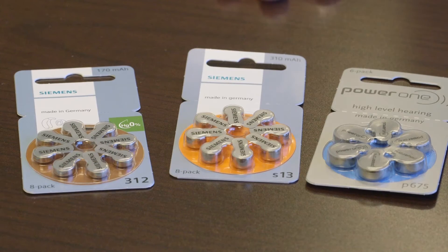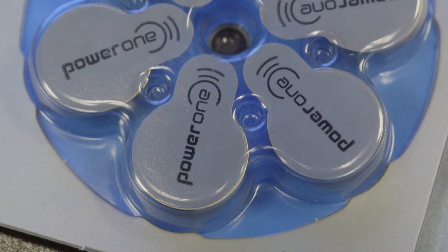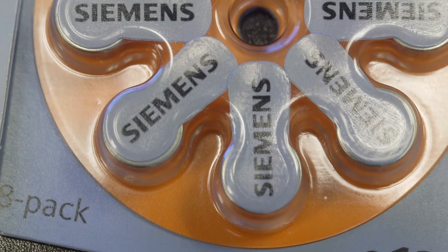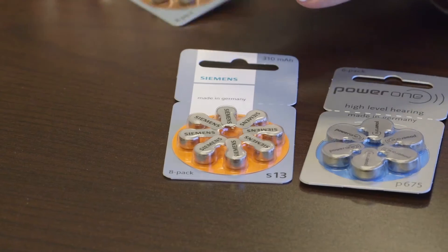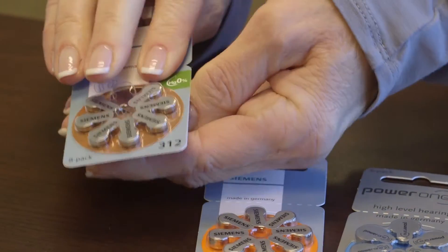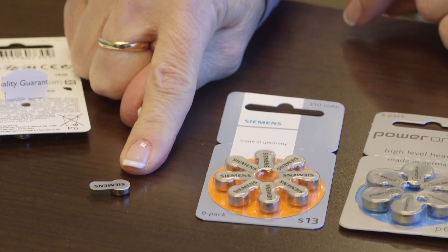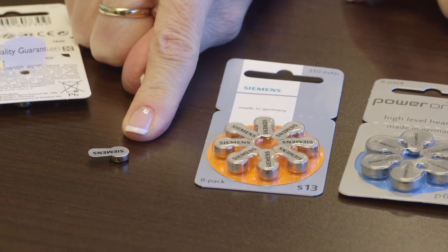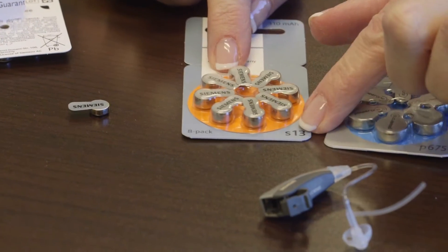All hearing aids use batteries to get their power supply. Hearing aid batteries are air-activated — no more mercury — so that once you peel the paper off of the battery, it's going to discharge. So you only peel the paper off when you're ready to use the battery. For this hearing aid, we're using a size 13.